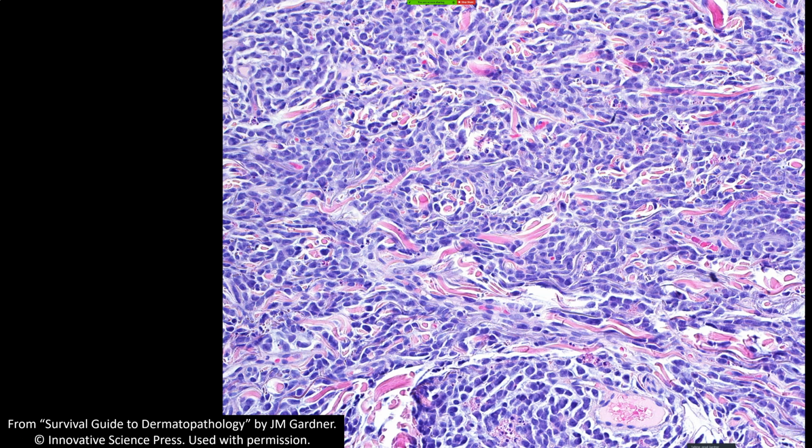known as c-KIT. But a lot of times when blasts get into the skin in leukemia, and maybe it's because they're more monocytic derivation, I don't know, this is a little bit beyond where my knowledge goes, they tend to not stain with those typical blast markers that are often used in the bone marrow as much. So the problem is that there's not one perfect stain for leukemia cutis. So I often do a panel of stains, including myeloperoxidase.